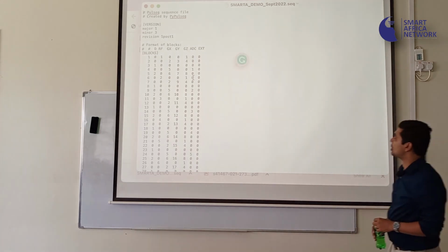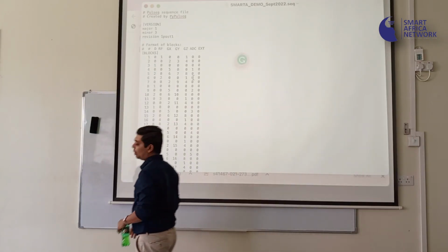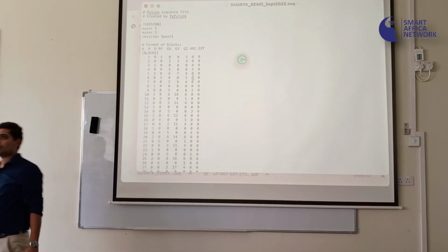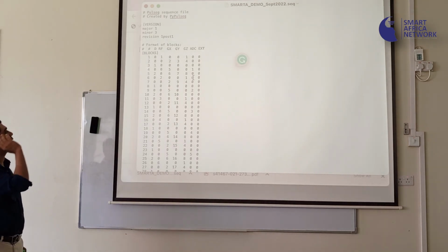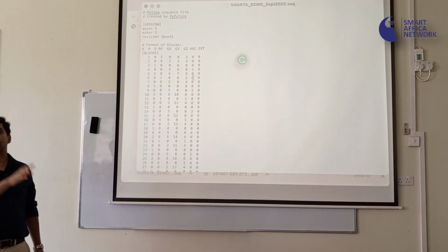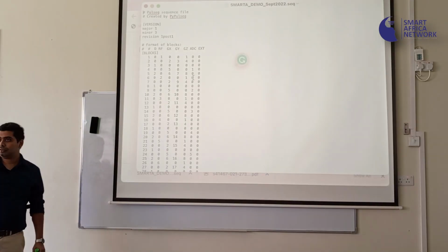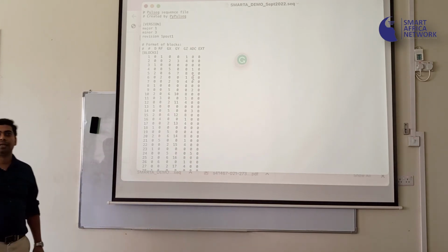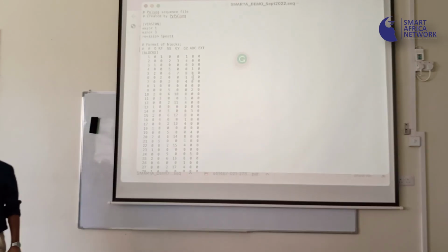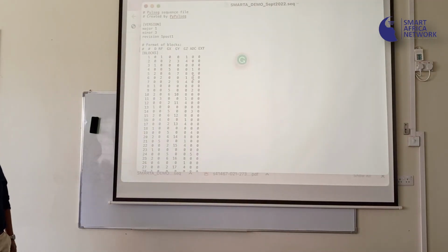So I'll just tell you what this is doing again very quickly so that you can connect to the hardware that you are putting together downstairs. It has the following different lines going out. The D stands for delay, meaning telling your hardware to do nothing. Then the next one is RF, telling your radio frequency coil that I'm going to play out a shape or a pulse on that coil.